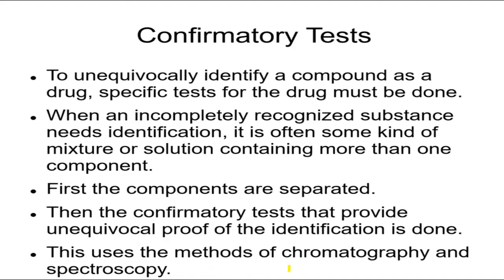basically chromatography is you have your solution with all kinds of stuff in it, all kinds of mixtures in the solution. You have it flow through a column or through piping, that special kind of piping that has stuff in it, and what will come out and as it flows through, everything will separate. So you can catch each one of these compounds, each one of these drugs, as they separate.